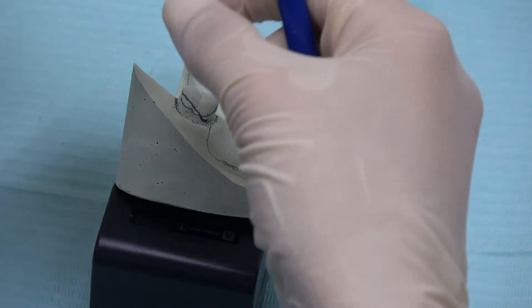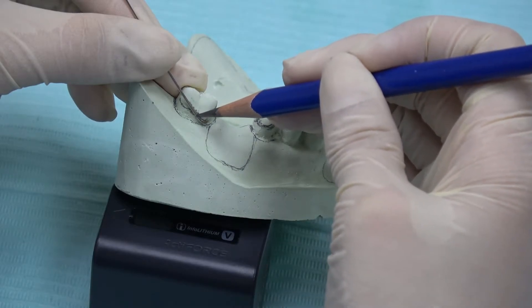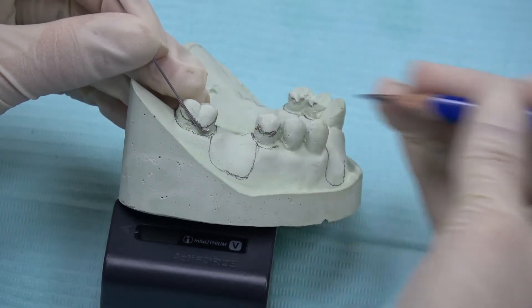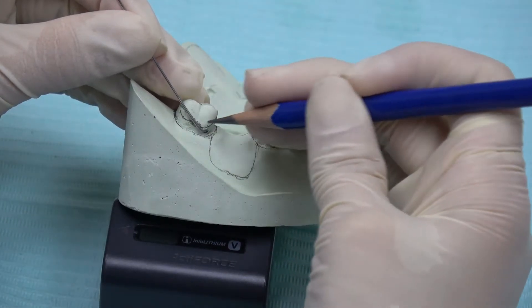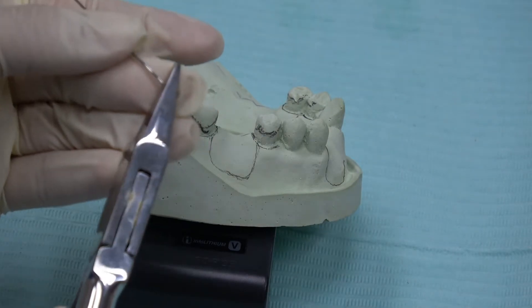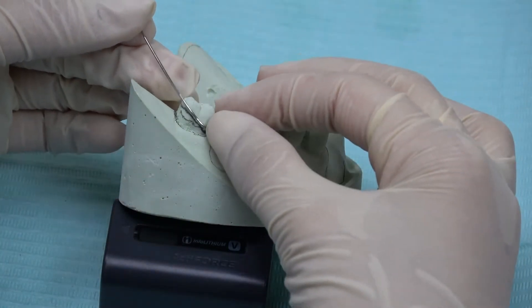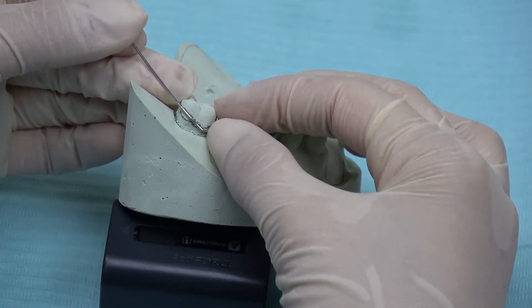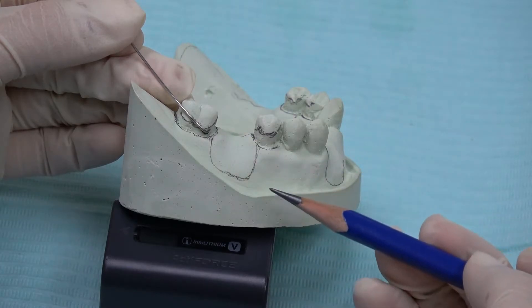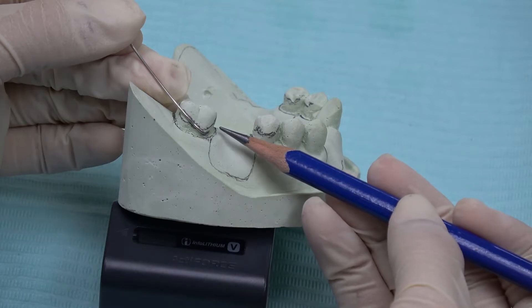Use the pencil to mark on the wire before bending it using Adam's plier. Put the wire on the teeth and mark it with pencil, and then bend it using spring form plier. After bending, please check it back on the teeth. Please make sure the tip of the clasp is not too close to the gingival margin and it shouldn't exit to the interproximal area.